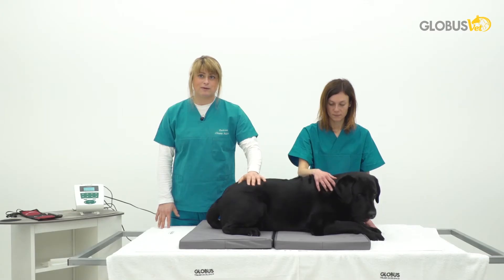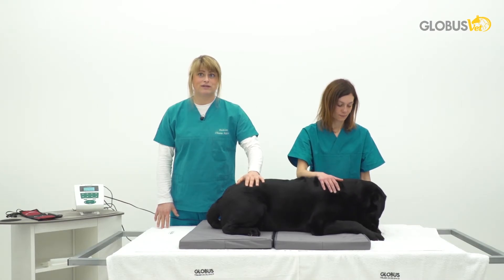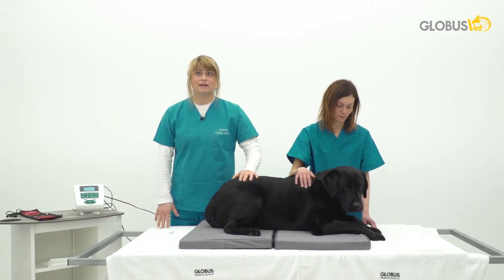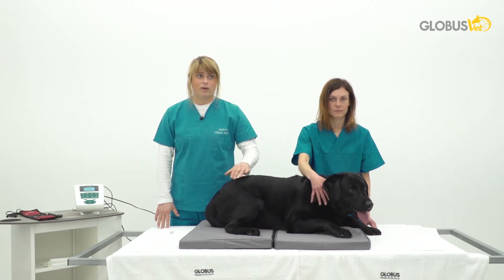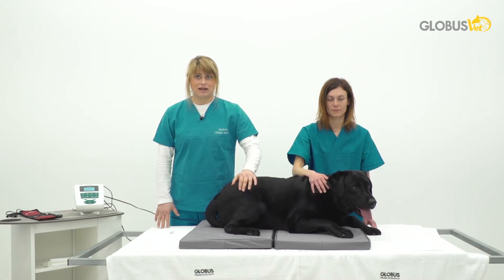It is a very nice and comfortable way of treating patients, especially good for patients that do not want to see the physiotherapist and want to be treated at home. Or it is a nice type of technology that we can use as an aid while performing other physical therapy modalities.